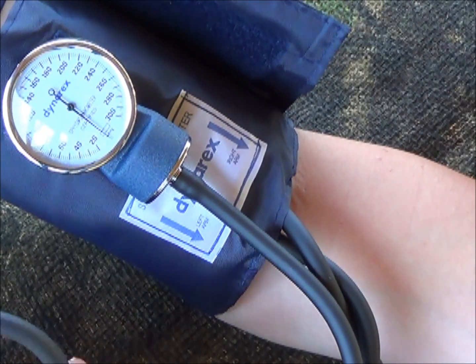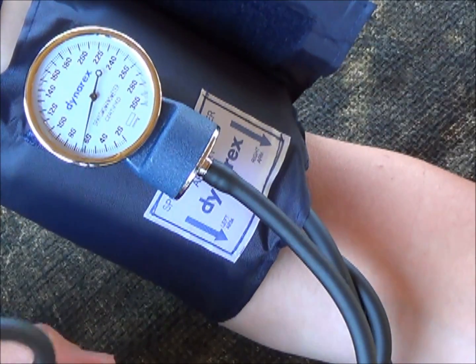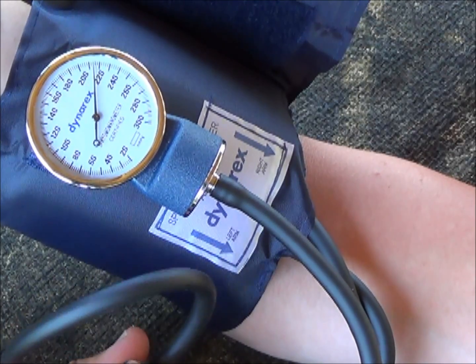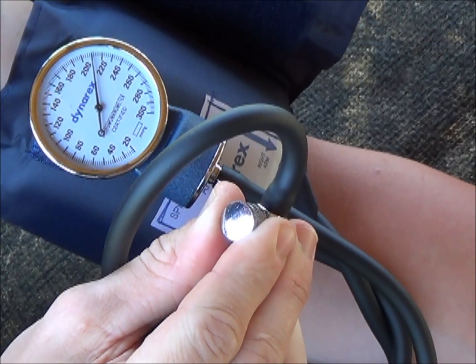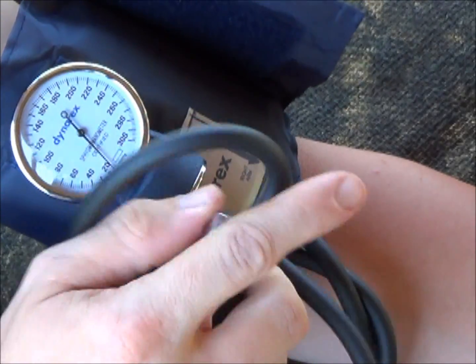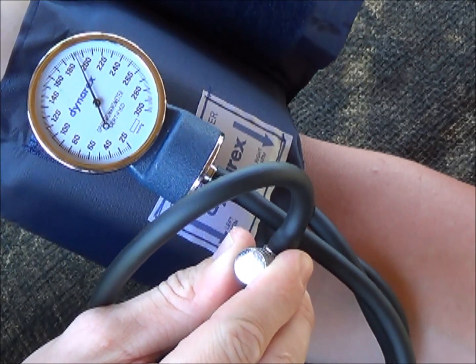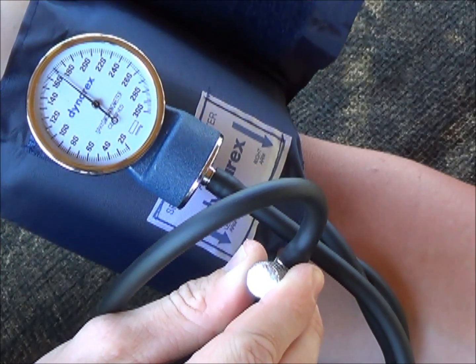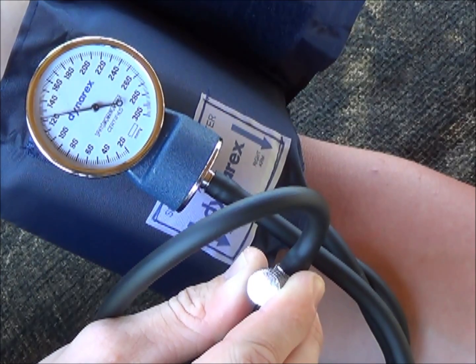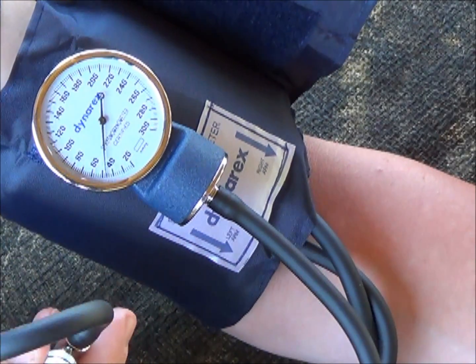With one hand on the radial pulse and the other hand on the bulb, valve tight, start pumping the blood pressure up. At some point you're going to lose the radial pulse — give it a few more pumps to make sure you're well above the measurement point. Then slowly open the valve just a little bit and watch the needle start to fall. Don't open it too much or the needle will drop too fast. Slowly release the valve while keeping your finger on the radial pulse. As the pressure falls, you will regain the radial pulse — and the moment you feel it come back, note where the needle is on the gauge. That is your top number, your systolic blood pressure.